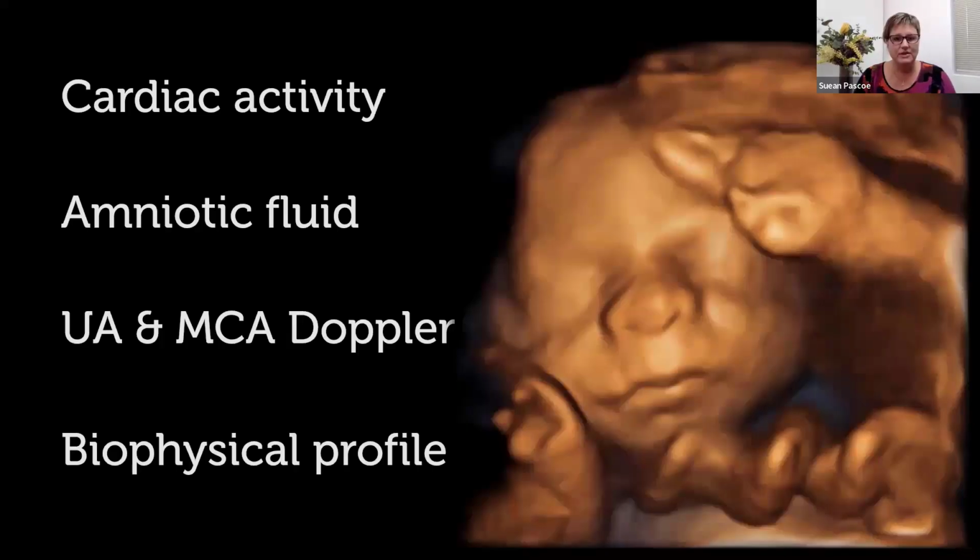I'm going to keep it just umbilical artery Doppler, because until you master that and can do an umbilical artery Doppler very easily and quickly, you shouldn't be messing around doing middle cerebral artery Dopplers. You have to have really good Doppler skills and ability to navigate your way around the machine so that you're not exposing the baby to potential thermal effects while we're trying to get the middle cerebral artery Doppler, which is pertinent given our conversation just before.